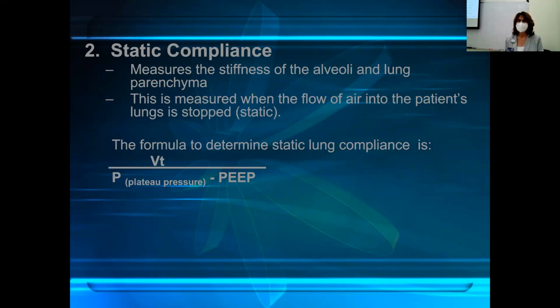So the inspiratory hold is going to give you a pressure reading, and it's going to reflect what the pressure is in the alveoli. And this is done at peak inspiratory? The newer ventilators, you press it and the ventilator will figure out when peak inspiration is. If it's an older ventilator, yes, you need to coordinate with peak inspiration. Okay. So you'll see the pressure building up and then you push the button.